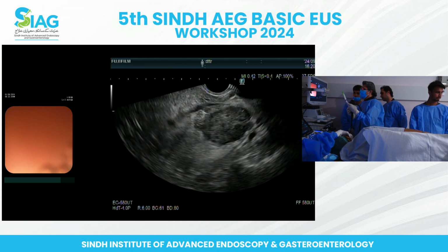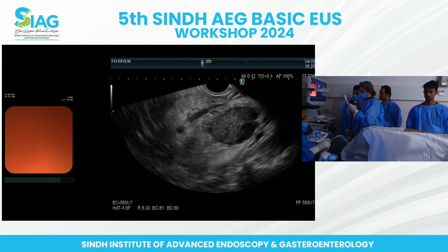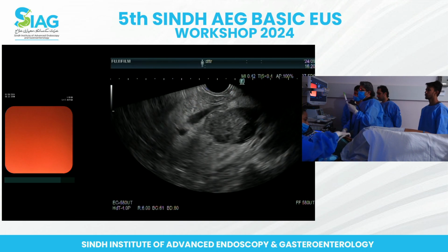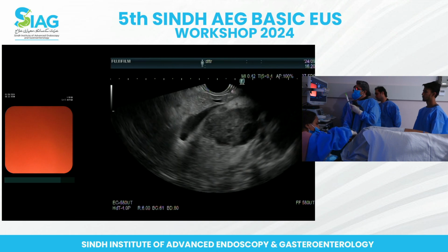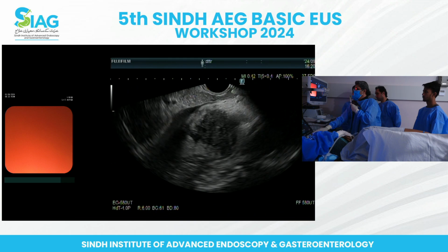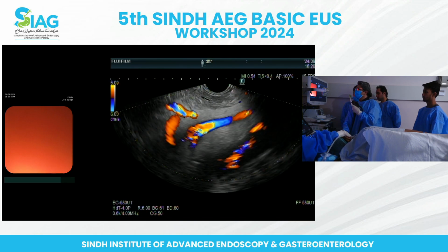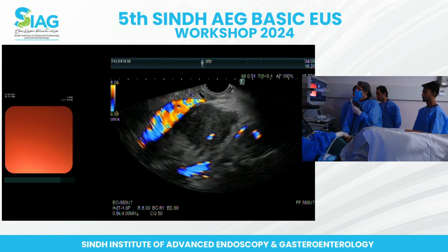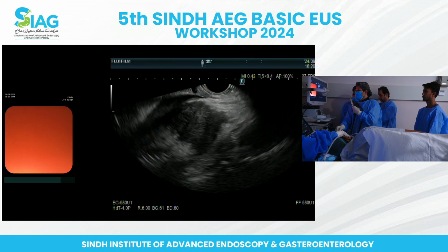Do you think there is a vessel you are just compressing in your way? You're just compressing the vessel in there. It's a big vessel at this point, but I think there is a window that I'll show you. What do you think? No, I think you're just compressing it. The vessel is there.